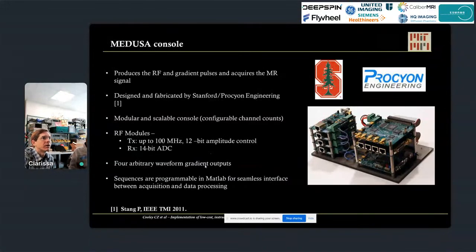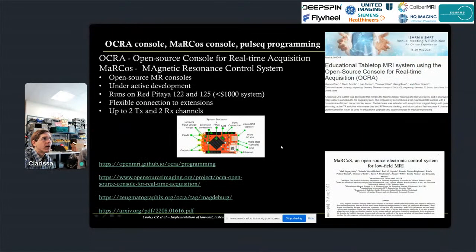I'll make a few remarks about the console. The original console, as you can see here, had an RF waveform generator and independent boards for each gradient axis that then drove DACs on our gradient amplifier PCB, and then a control board. This Medusa console was controllable from MATLAB, which made it very convenient to generate user interfaces and to pipe the data back in for students to process it.